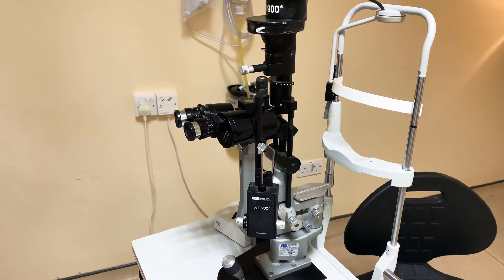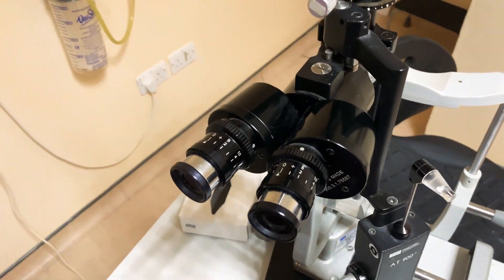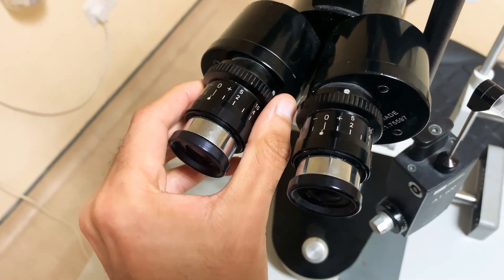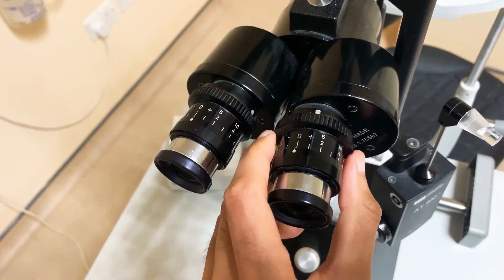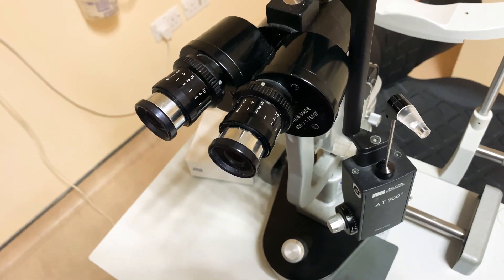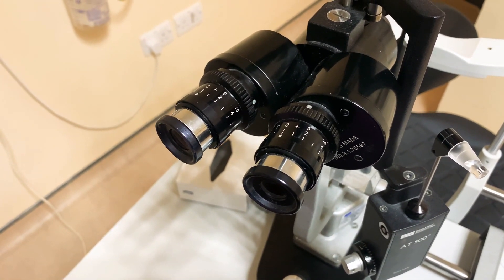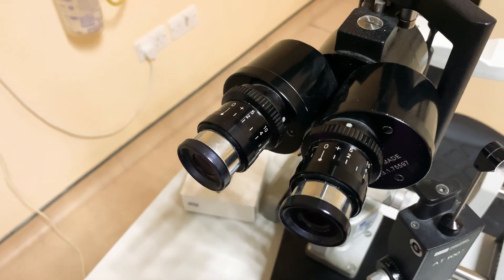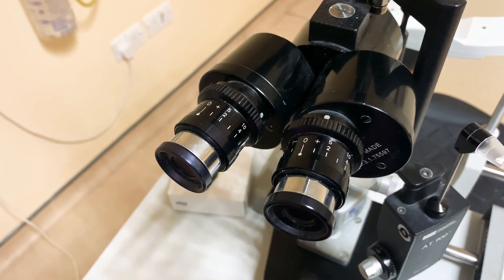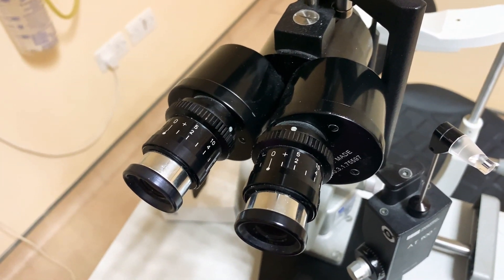Starting from the absolute basics, I would recommend that when you're considering looking through the slit lamp, if you wear glasses, just wear your own glasses and make sure that the oculars are set to zero on both sides. This only accommodates for your spherical prescription, not for any astigmatism, so you might not even have a great view even if you're dialled into your correct prescription.